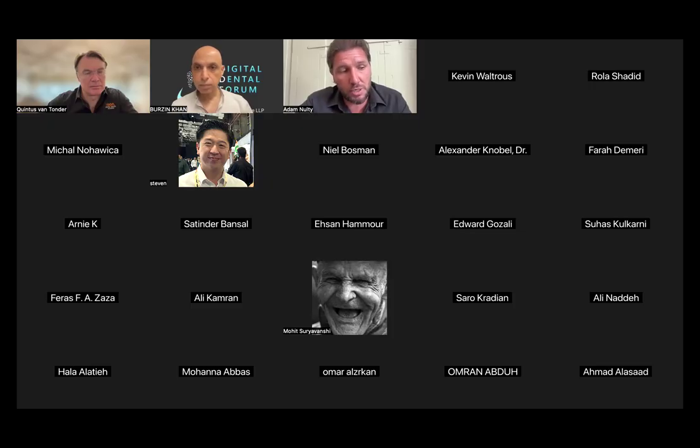What he's picked up from doing probably well over 100, 200 ScanLadder cases now with people all over the place is that, from his perspective, he would always recommend taking a new scan once the integration is completed, simply because of potential micron movement over that 3 to 6 month period, depending obviously on whether you've had a prosthesis in place or not, just to make sure that everything is in the same place.